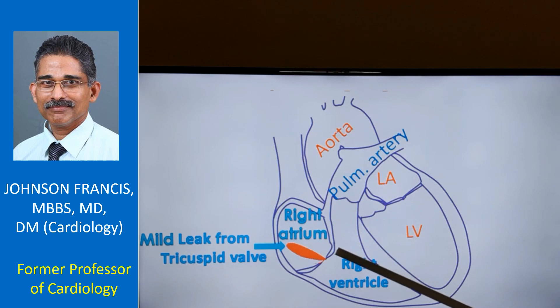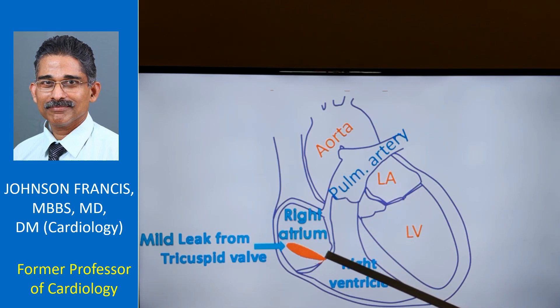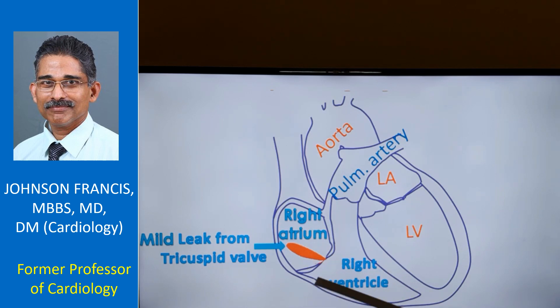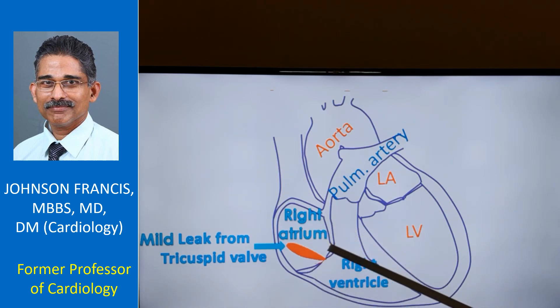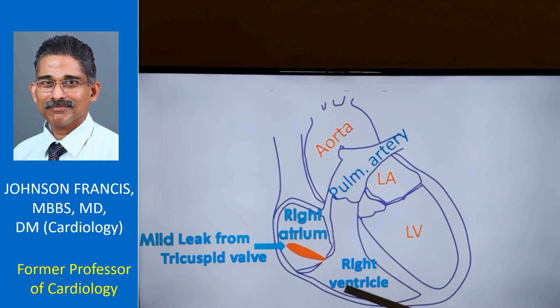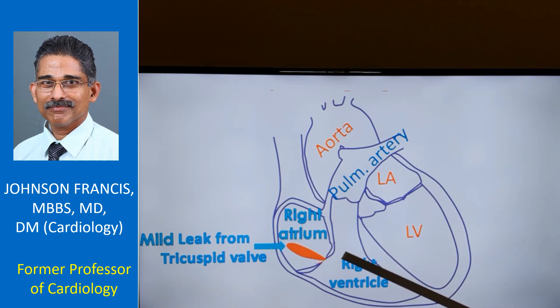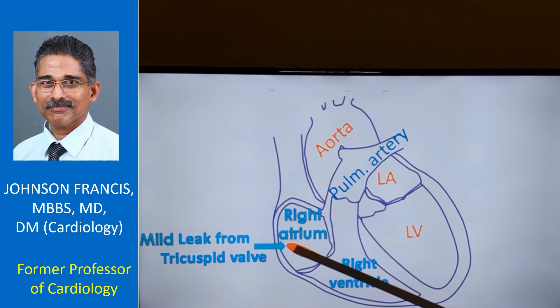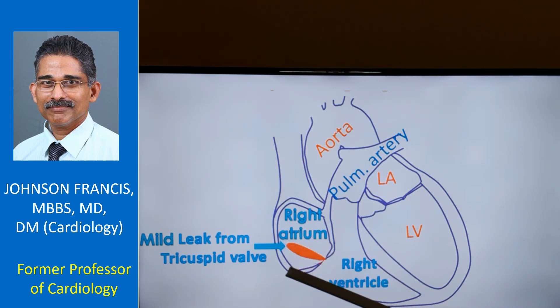Mild tricuspid regurgitation is just a small leak from the tricuspid valve. Normally the tricuspid valve is expected to close fully and prevent back-leak of blood from the right ventricle to the right atrium when the right ventricle contracts. But even in nearly normal persons, there could be a little bit of leak in the tricuspid valve.